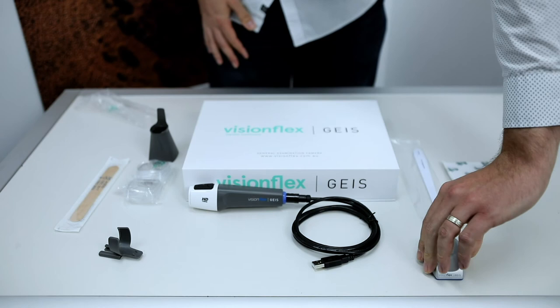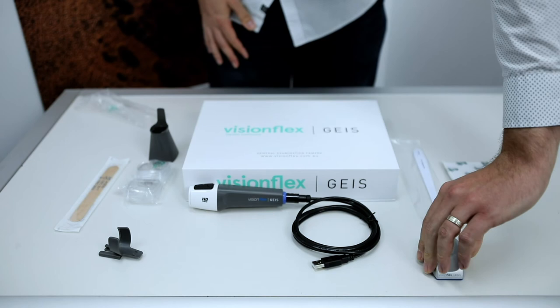Place the supplied GEIS cradle within reach of the camera so you can rest the device safely when not in use. For more information on the GEIS attachments please refer to our other videos. You can also contact us and visit our website at visionflex.com.au.